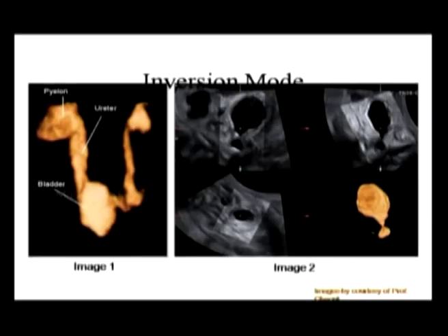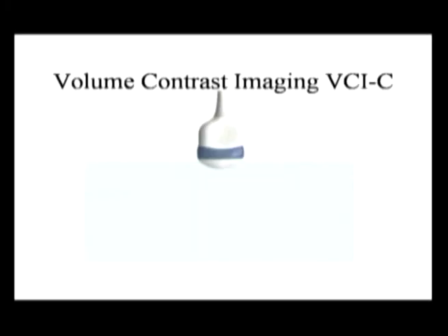And you can easily make out this obstruction at the level of the bladder, at the level of the urethra. So this can be seen and shown to the doctors as well as to the parents that here at this level we have an obstruction, and this has to be cleared after birth. An early detection of such a condition helps the parents as well as the doctor who is going to treat to plan things accordingly, even the delivery and the period immediately after delivery can be taken care of.